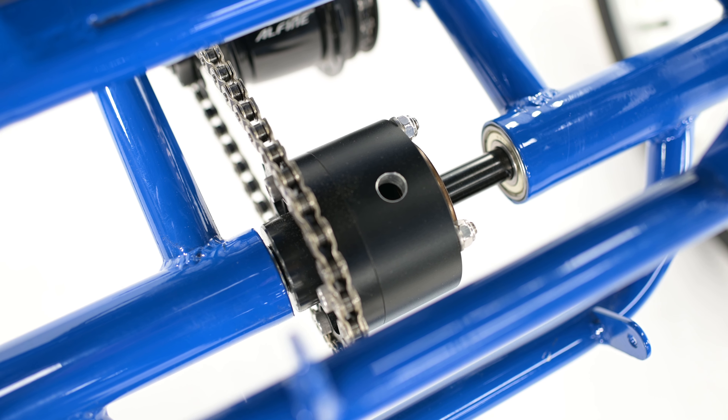One upgrade we have added to the hand and foot cycle is our UT Custom Posi Differential, which means this trike is two-wheel drive. You'll benefit from increased traction and power to the wheels.